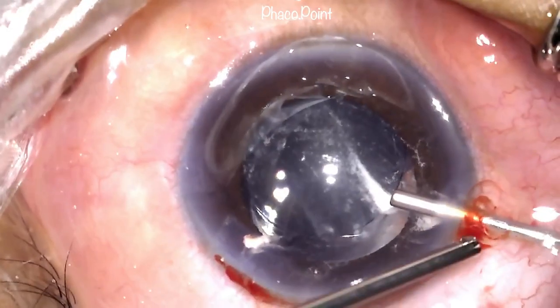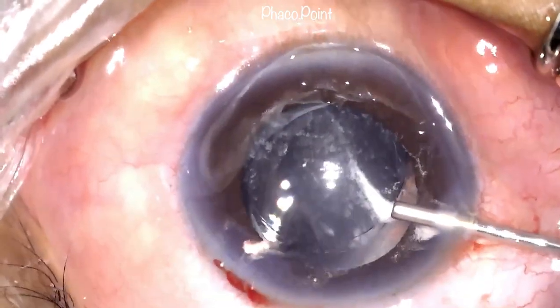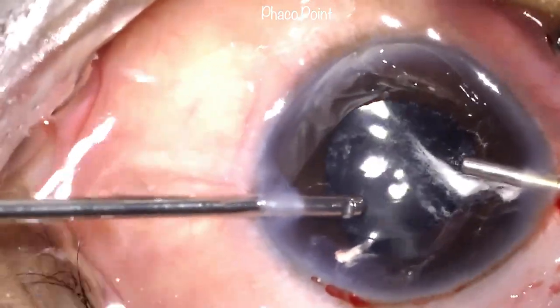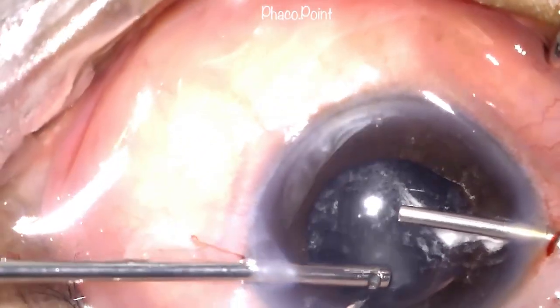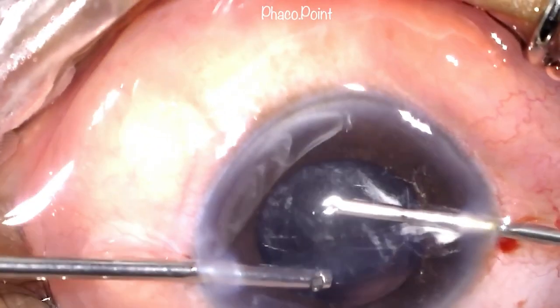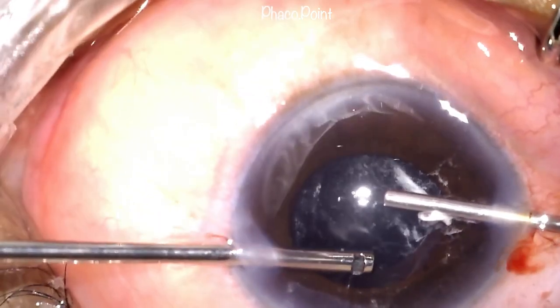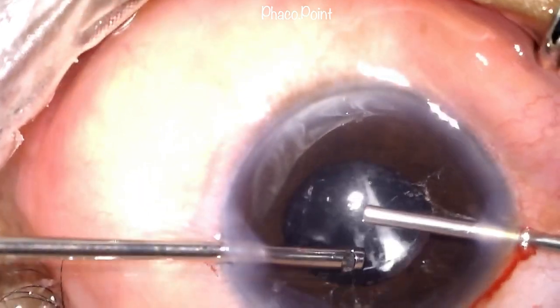Whilst proceeding with the anterior vitrectomy, we have to ensure at all times that the IOL still remains stable. Note how the vitrector largely stays in its place, cuts the vitreous before moving forward to cut any more vitreous in any other part of the eye. At all times, we need to ensure the stability of the IOL.